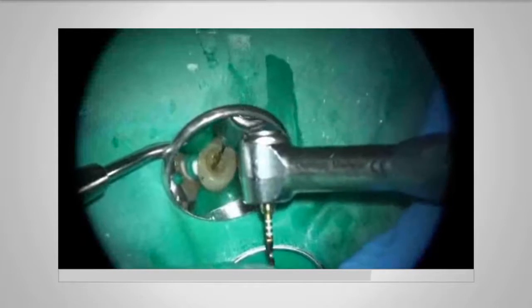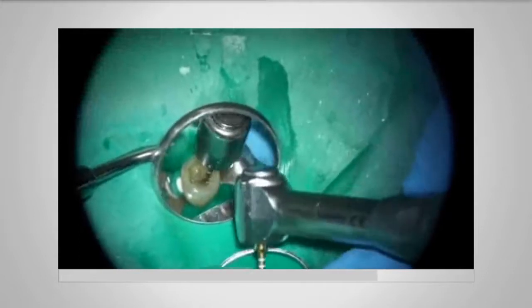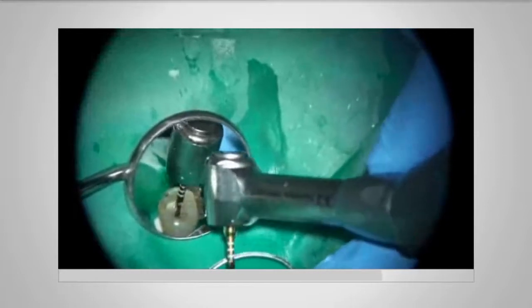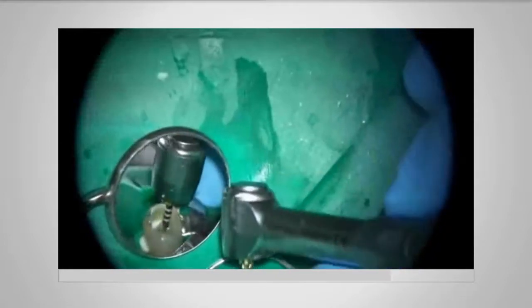I let the Wave 1 Gold instrument feed into the canal and then brush into the bulkiest wall, and then it will drop down a little bit further and work a little bit more apically, and I carry on doing this. 2 or 3 passes is normally sufficient to prepare the entire working length.